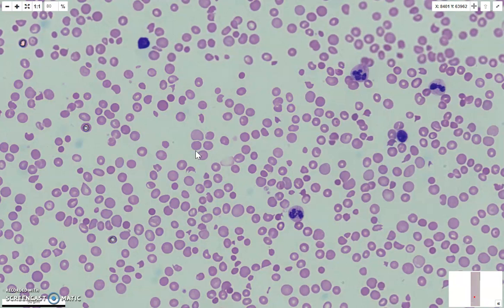I'm following through with the hemolytic anemias that you have been covering. I'm going to present 4 slides. 2 will be MAHAs and 2 will be variant hemoglobinopathies. So let's start with this one. This one is slide 33-1A.